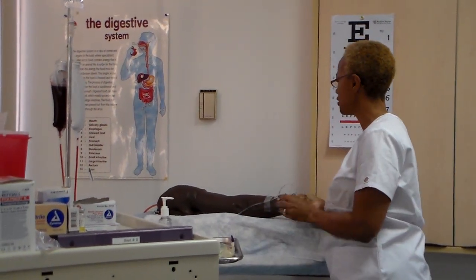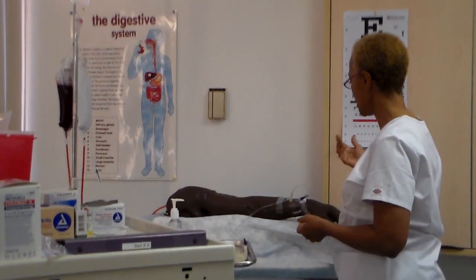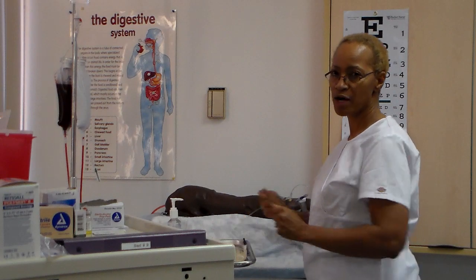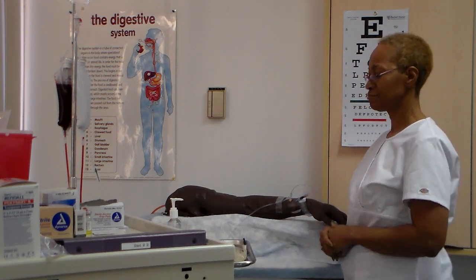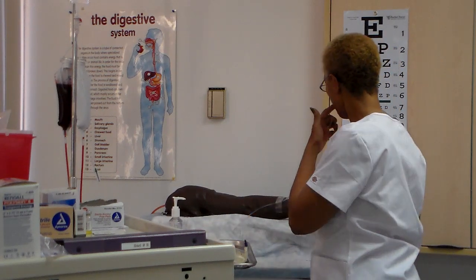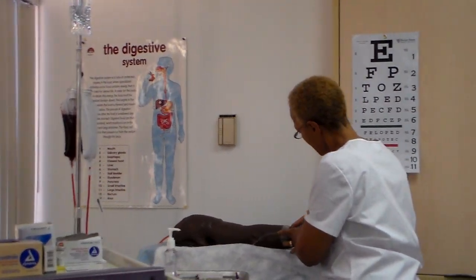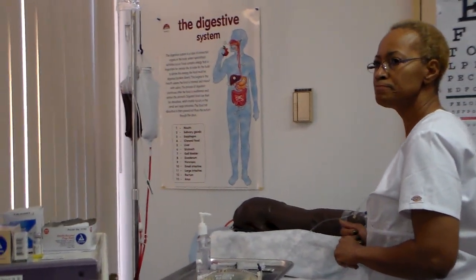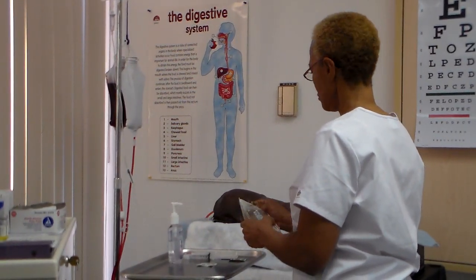Can you please state your name, full name, and date of birth? Give me the full name and date of birth, and then I'll check your ID band. Make sure that matches. Identify client using at least 2 client identifiers. Compare client's name and one other identifier on MAR, computer printout, or computer screen with information on client's identification bracelet. Okay. Third check. Ask client to state name if possible for a third identifier.